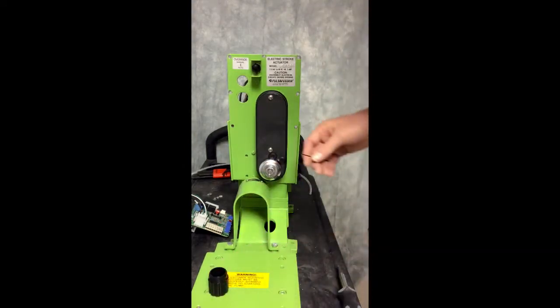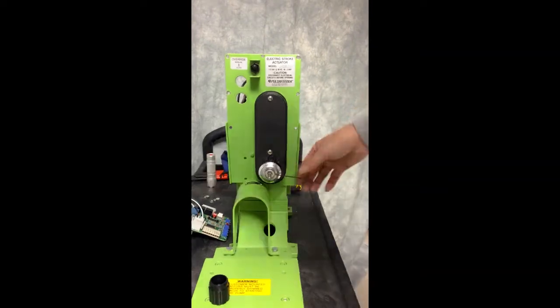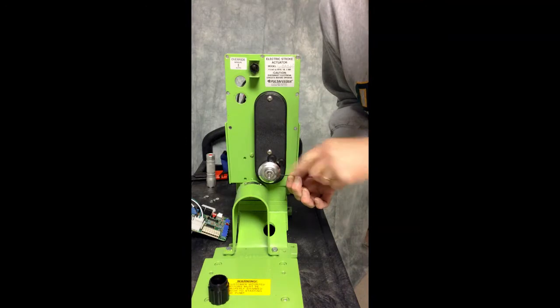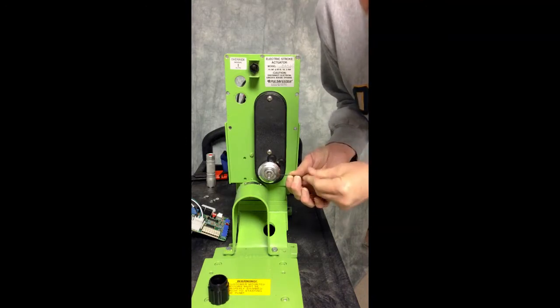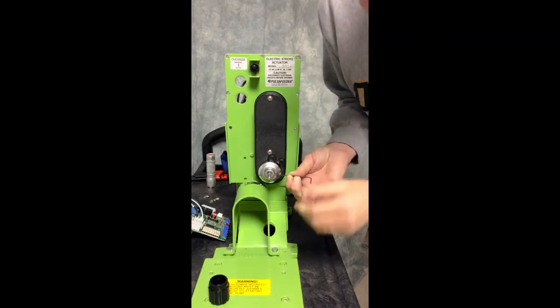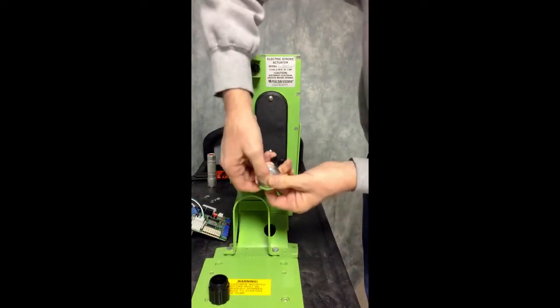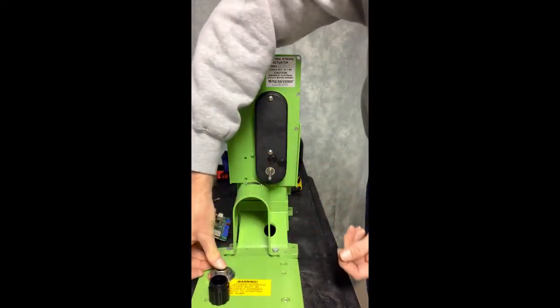Place that aside so you'll have it for later. Using the 1/8 inch Allen head, loosen the screw that is holding the DUO dial on and then you should be able to remove that. Set that aside for later use.